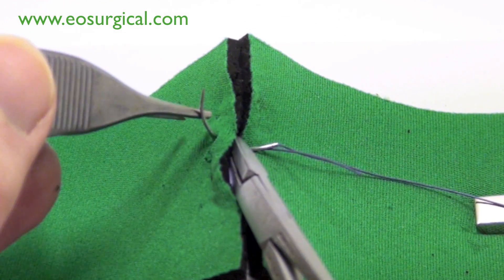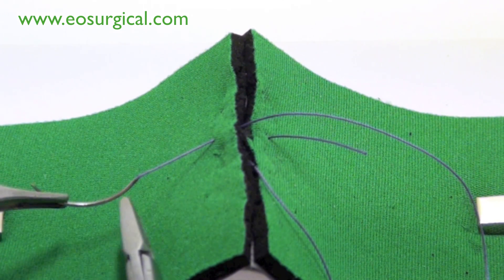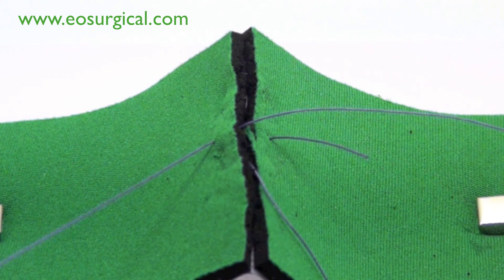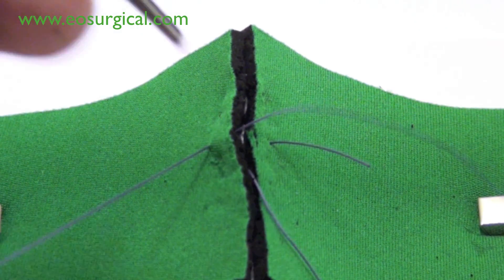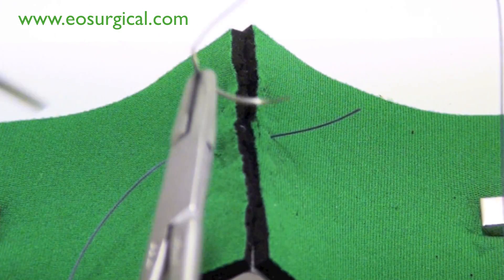This is the exiting at point B here. Then those reversed. Re-enters the tissue at point C.